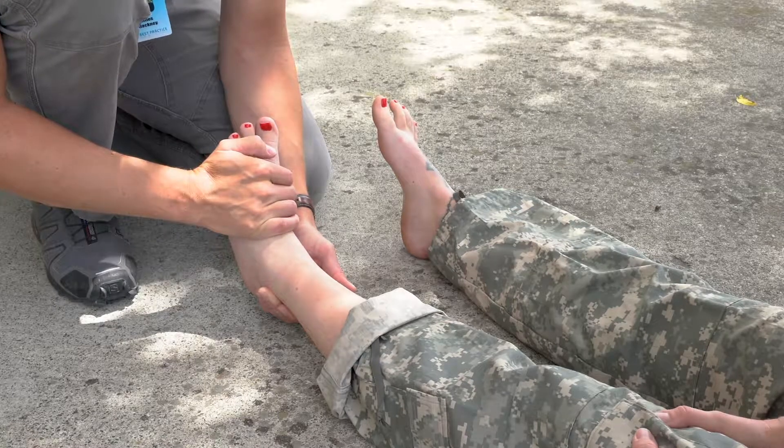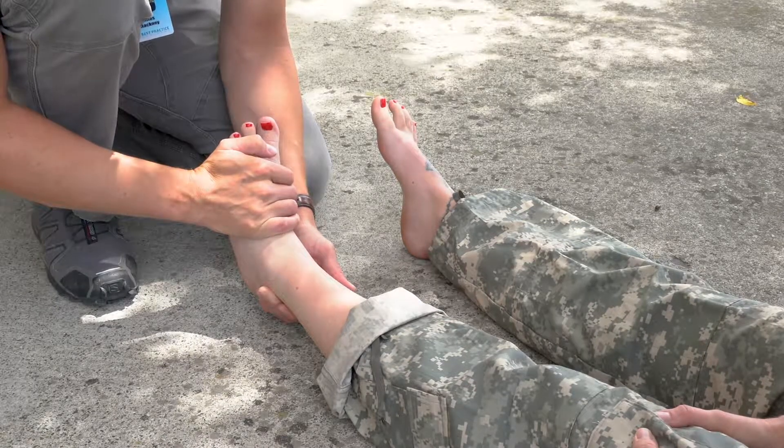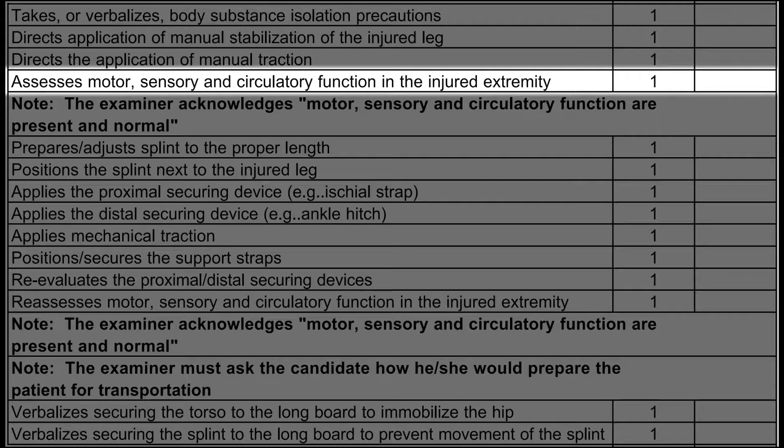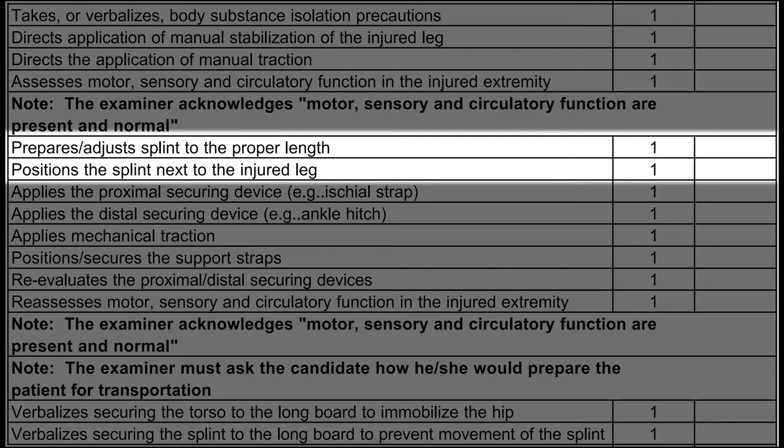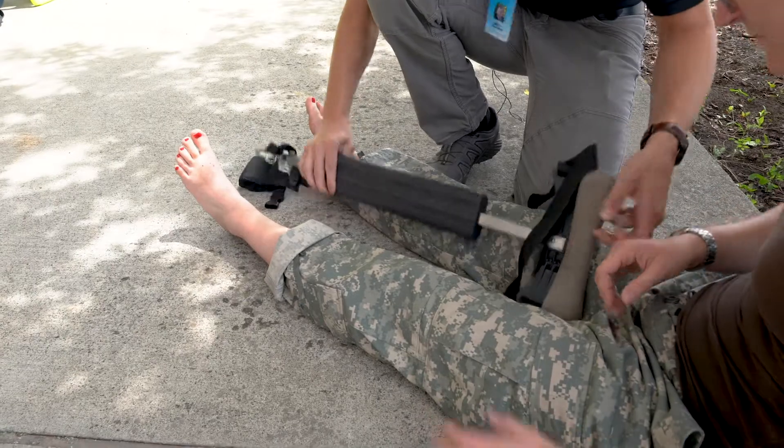Once manual traction has been applied, do not release it until it's been replaced with mechanical traction. Once your partner has initiated manual traction, obtain a baseline assessment of the patient's circulation, sensation, and motion in the injured extremity distal to the injury site. Then prepare, adjust, and position the splint next to the injured leg.